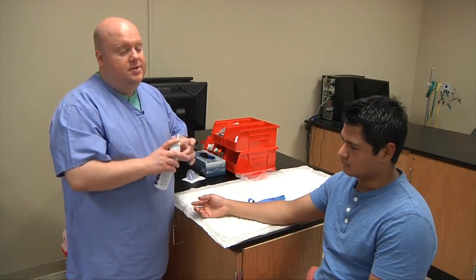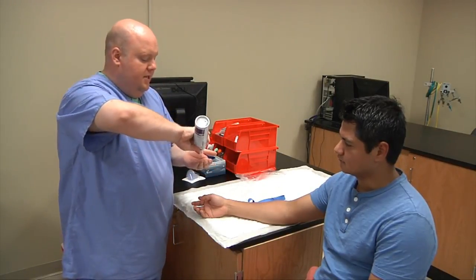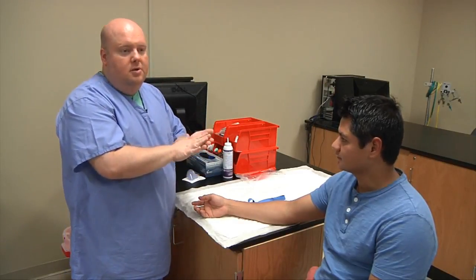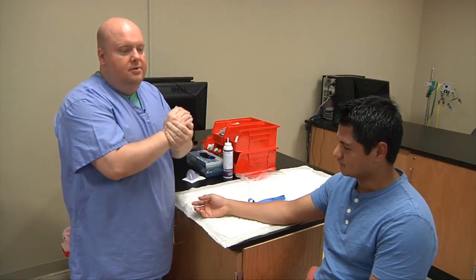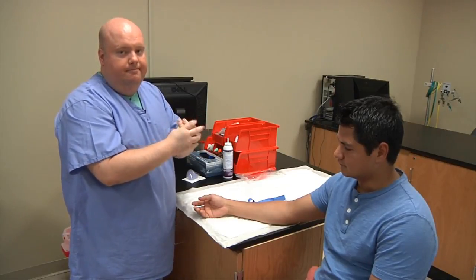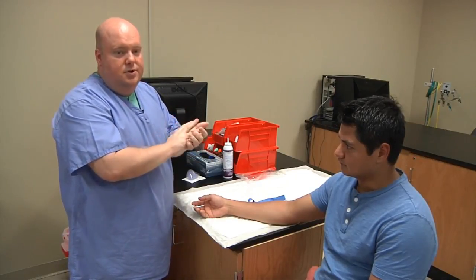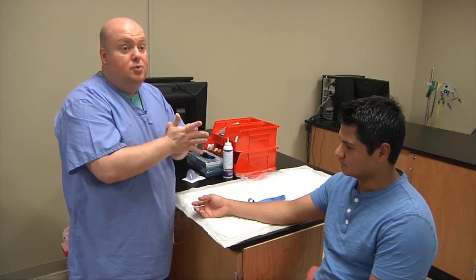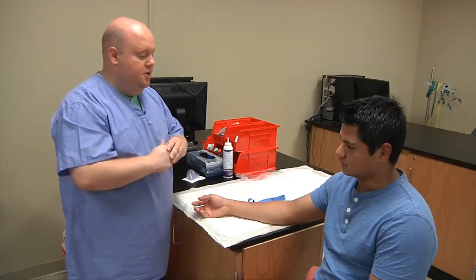First thing we want to do is wash your hands or sanitize your hands. Put a little bit of hand sanitizer in your palm and rub until it's completely dry — that takes about 15 or 20 seconds. If you wash your hands, hum happy birthday twice to yourself to make sure you've washed long enough.